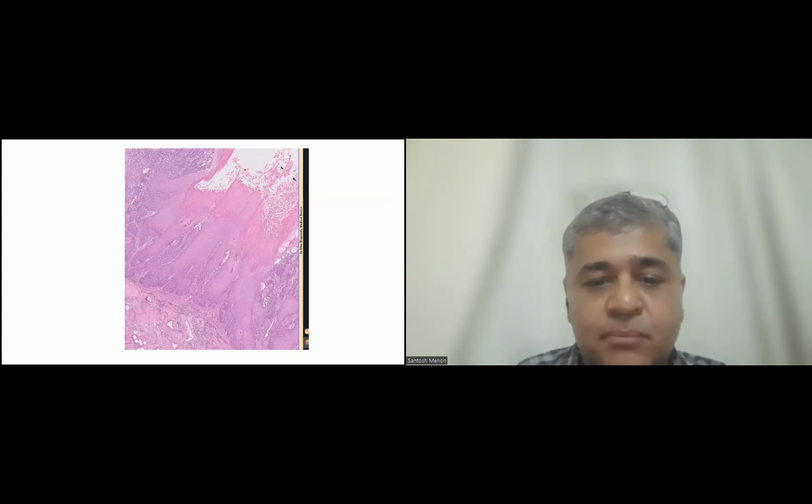So these are some pictures to show verrucous carcinoma. You can see this is a complete whole scan of the slide. You can see that this has got broad pushing fronts.